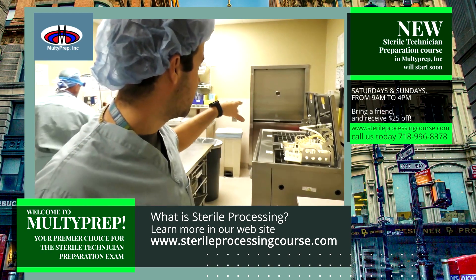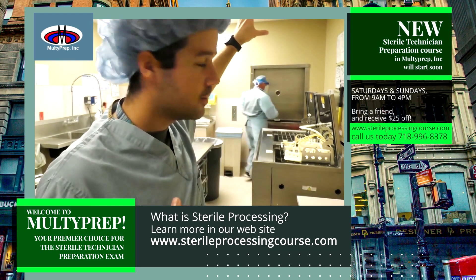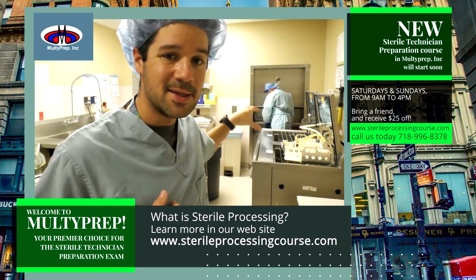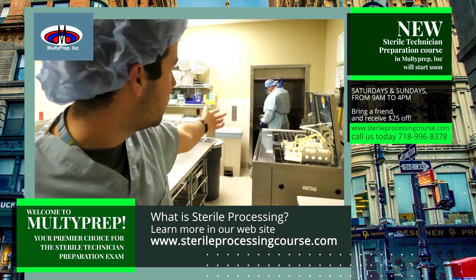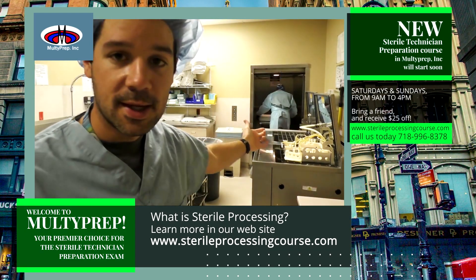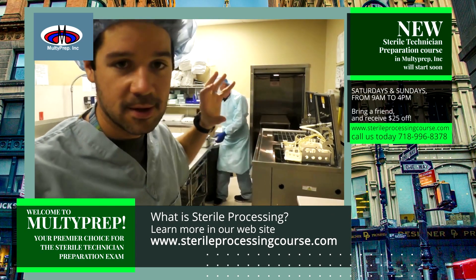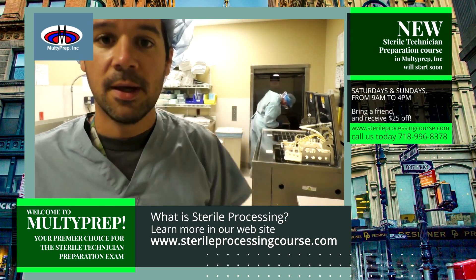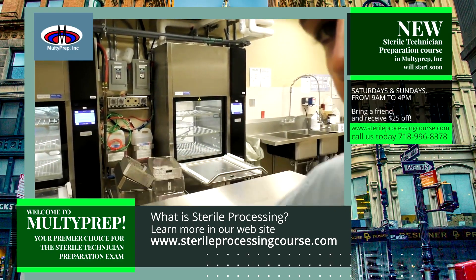This is the other end of that elevator — it comes from the dirty room upstairs, down this dirty elevator, into the decontamination room. In this decontamination room, as you can see, he's taking the instruments out and will go through the process of washing those instruments, and then they go into our washers over here.